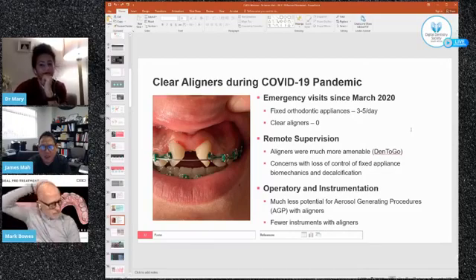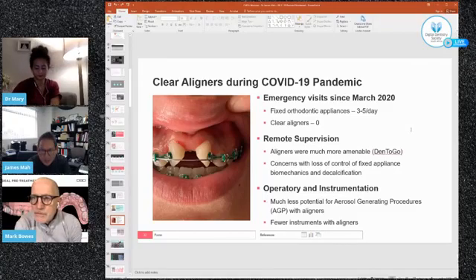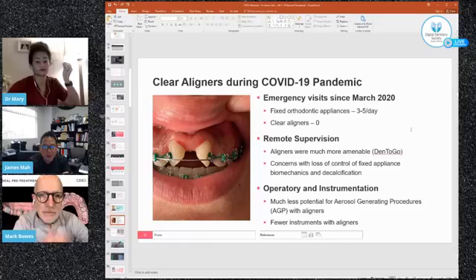With fixed appliances, if there's forces that remain active and one thing breaks or cuts loose, it can really be to the detriment of the patient. So what we have here on the left side, I think you recognize the brackets and the arch wire, but the green is the closing chain. The closing chain broke in the patient's midline, and the elastic closing chain remained active for many weeks and months when the patient should have been seen. But of course, because of the pandemic and other events, the patient could not come in. Finally, it got to the point where this young patient's central incisors were rotated almost 90 degrees, and the parent became very aware of it and brought him in as an emergency to take care of it.